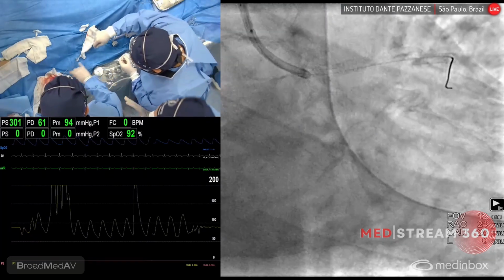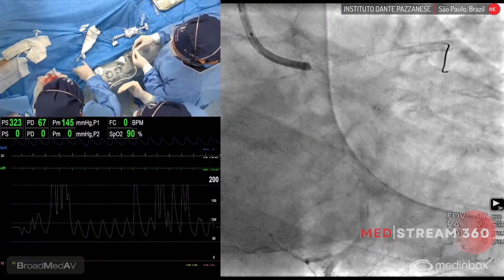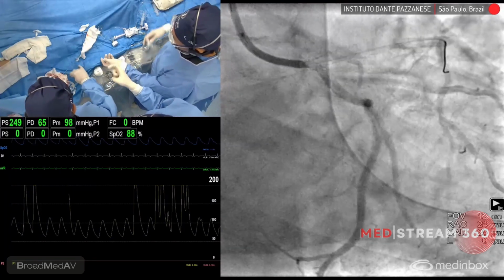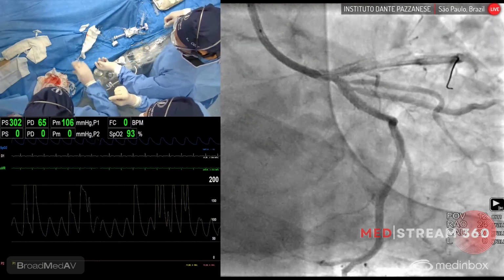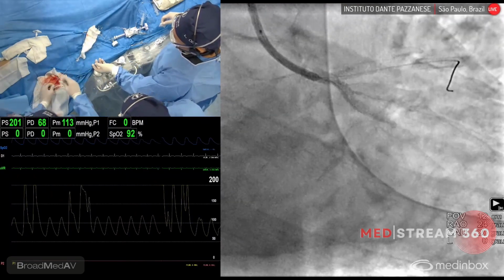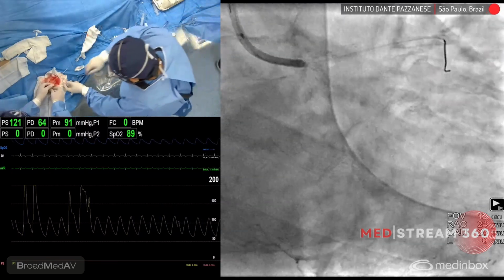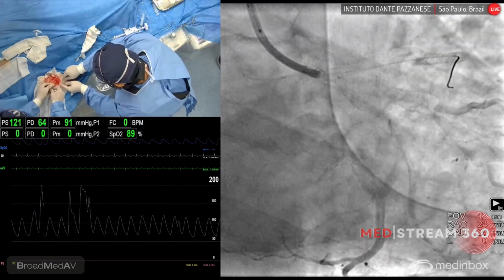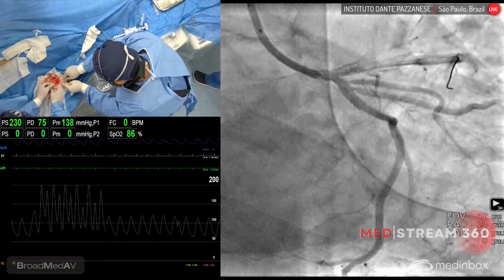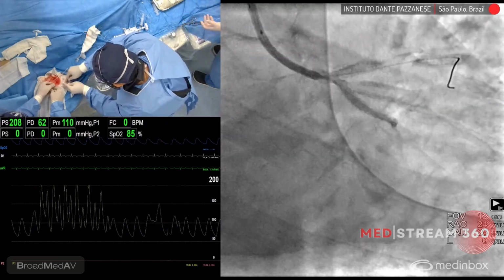So now, Rodolfo, what are the steps? Do you decide to post-dilate first, then stent in the LAD, then do a POT, or do you try already to recross the wire into the circumflex first? What's your recommendation? First, post-dilate. Remember, you don't have wires now in the circumflex, but you do have a patent circumflex, and I think that's a beauty and potential benefit of this technique.